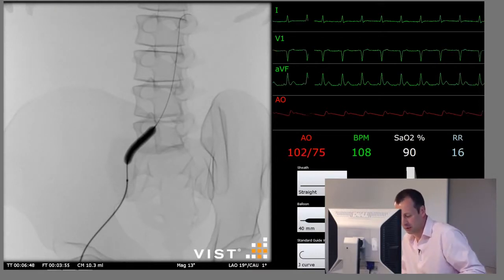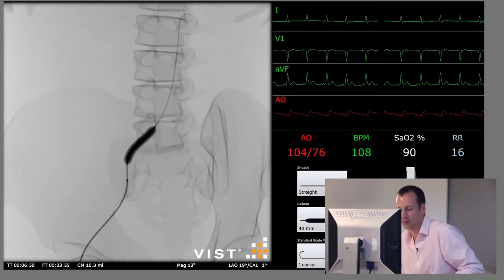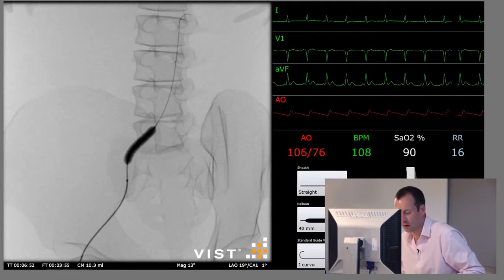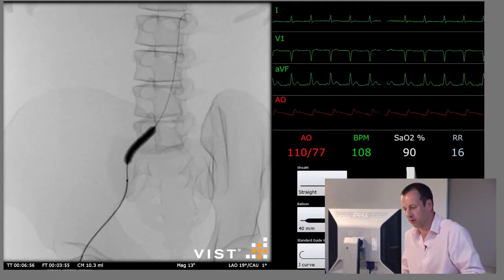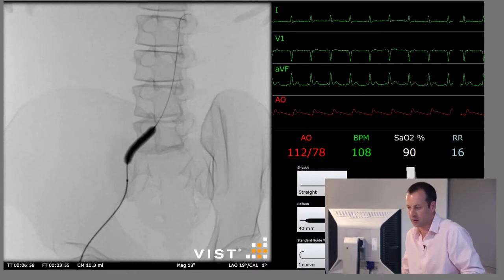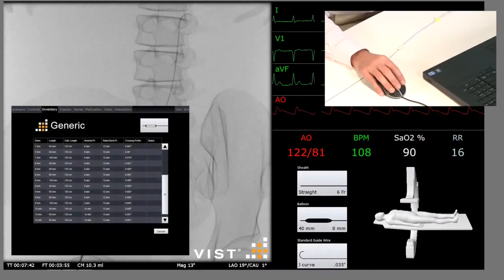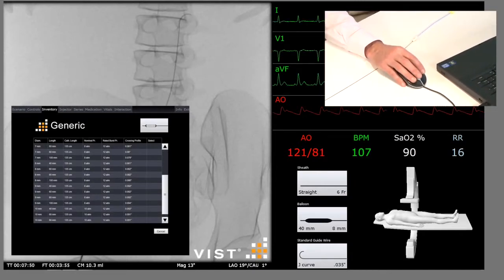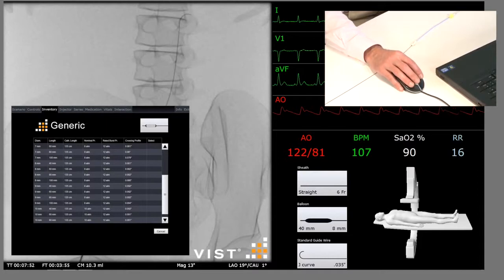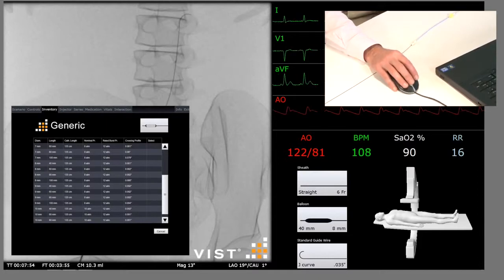First step, if you're not a vascular surgeon, is to ring one and alert them that they may need to free up an operating theatre. Your ultimate bailout is laparotomy and repair of the vessel. But generally speaking, you can bail yourself out with endovascular techniques. So we need to select the appropriate size covered stent. We know that the vessel is 8 mm in diameter. We only have balloon expandable stents. Therefore, we use an 8 mm diameter, 4 cm long stent to cover the lesion.